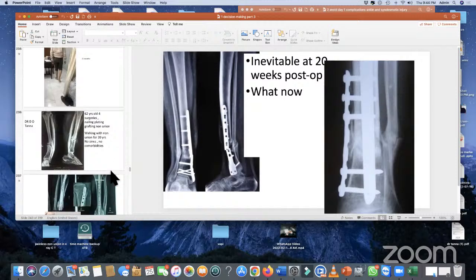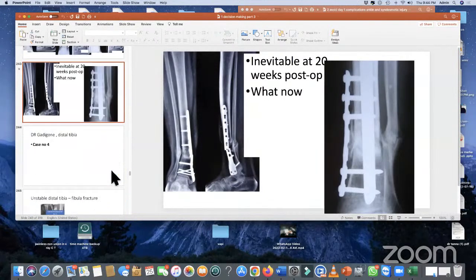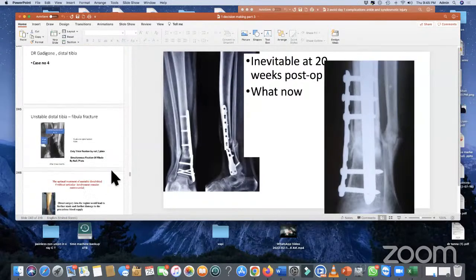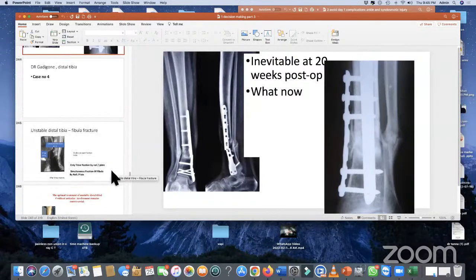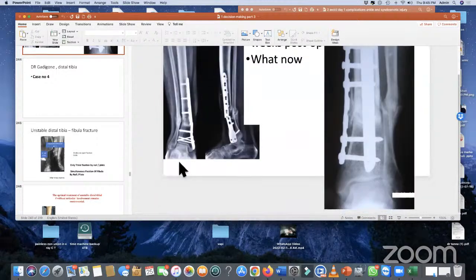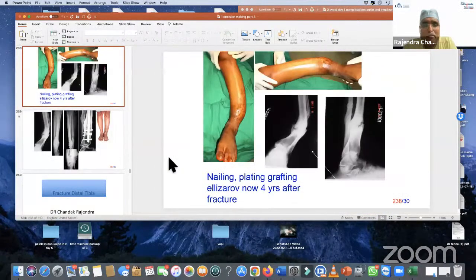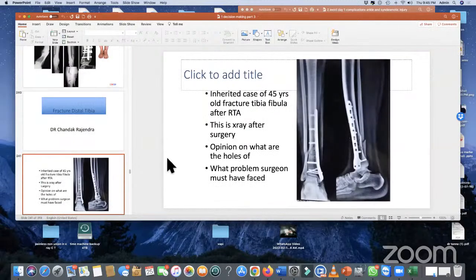Excuse me, sir. I have a question, sir. In the same X-ray, if the primary surgeon would have done a plate fixation of the fibula, we would have overcome the valgus the patient has now. Whether the fibula should be fixed first or the tibia should be fixed first?